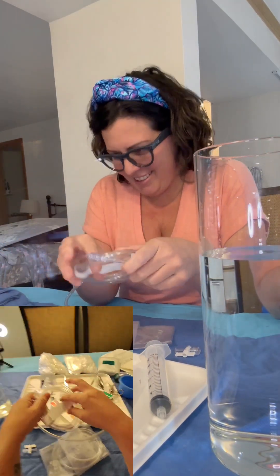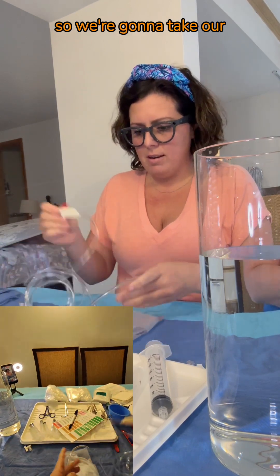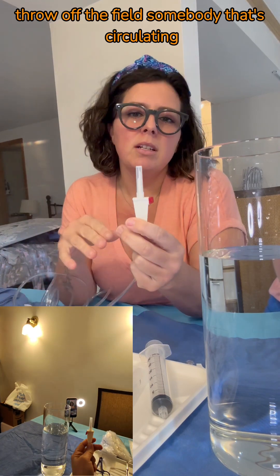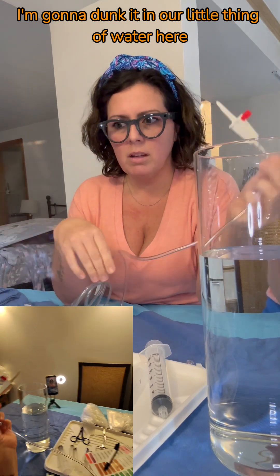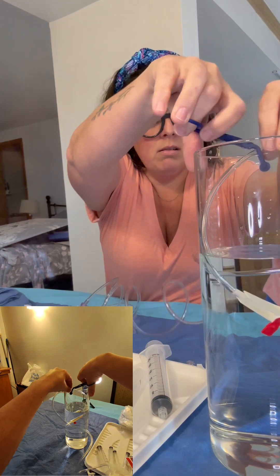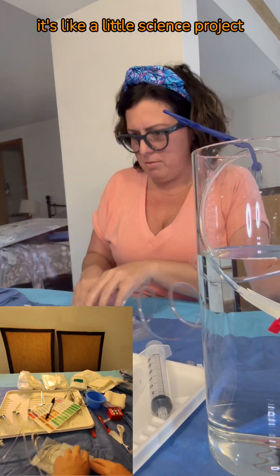A cup of water — a huge cup of water. We're going to take this end, which is the end we usually throw off the field. Somebody circulating can puncture a bag of Hep saline or normal saline. I'm going to dunk it in our little thing of water here, and then maybe use a clip to keep it anchored. There we go. It's like a little science project.